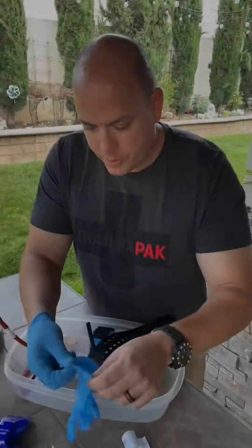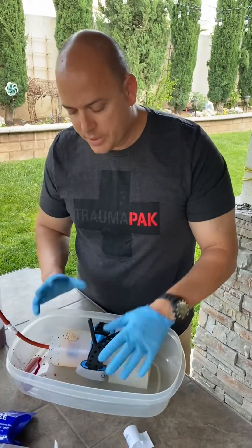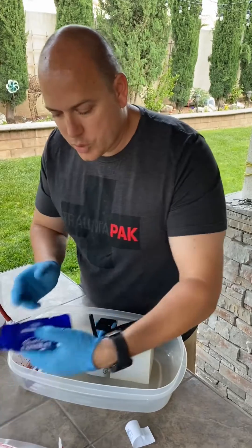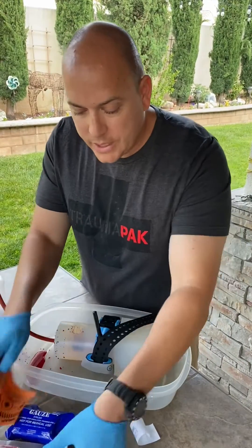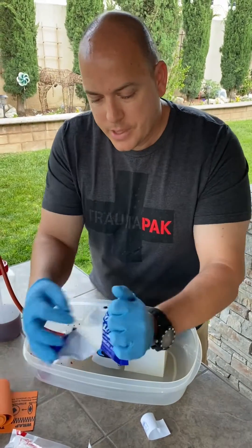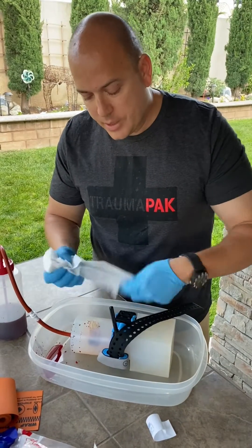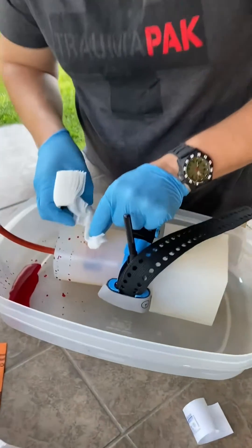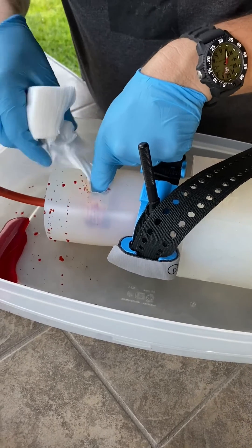After securing the tourniquet and stopping the bleeding, we reach the two-hour mark, where all the data shows that no damage will happen to the extremity within those two hours. Now I'm grabbing my equipment: I have my gloves, some QuikClot, and a wrap that I'm going to use to wrap the gauze after it is packed. You don't have to use QuikClot — any type of cotton gauze or other hemostatic agent would work.